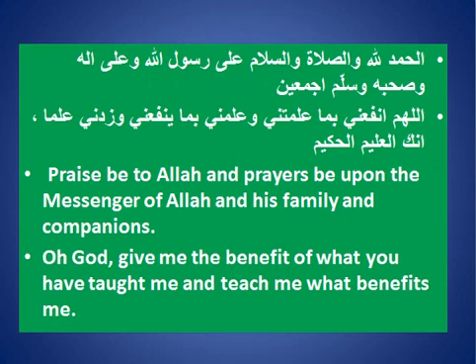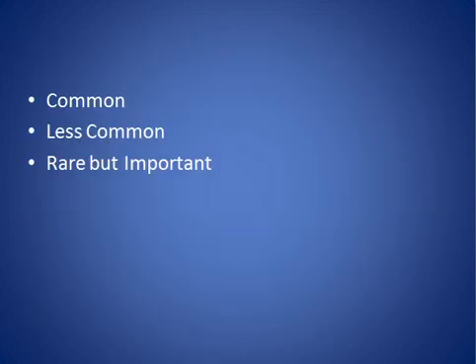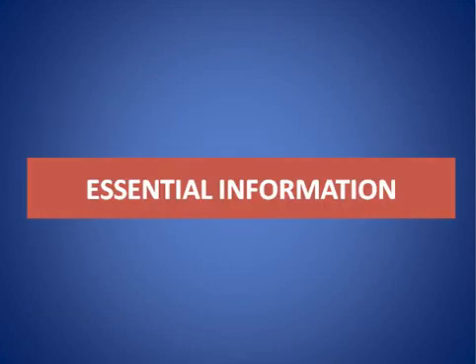My topic today is about cardiac calcifications, differential diagnosis with some examples. There are common causes and less common causes and rare causes but important.